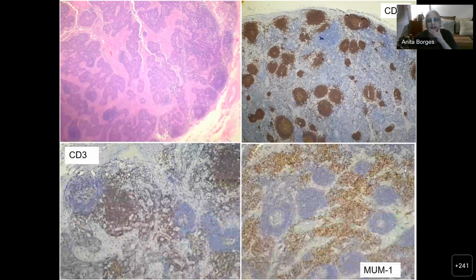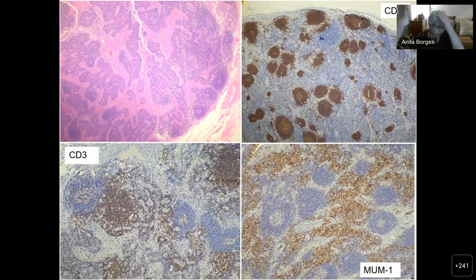Okay, right. So now let's look at how this immunohistochemistry is done and how it is expressed. Now here you have this lymph node, as I showed you. Okay, and you can see that I have really taken the immuno profile for CD20.